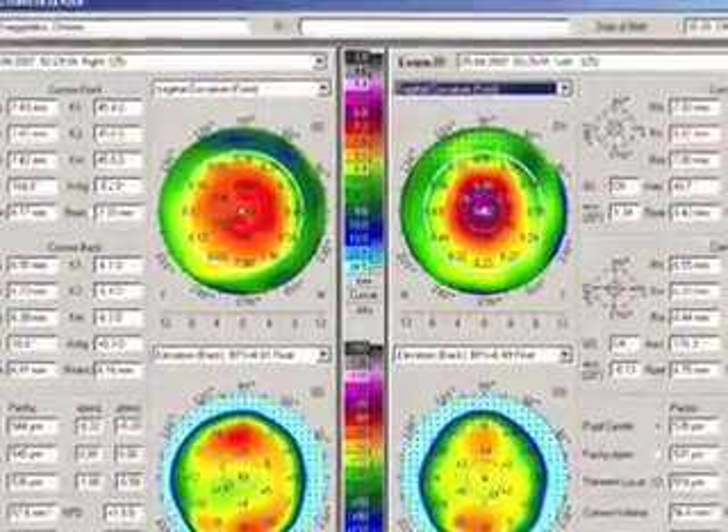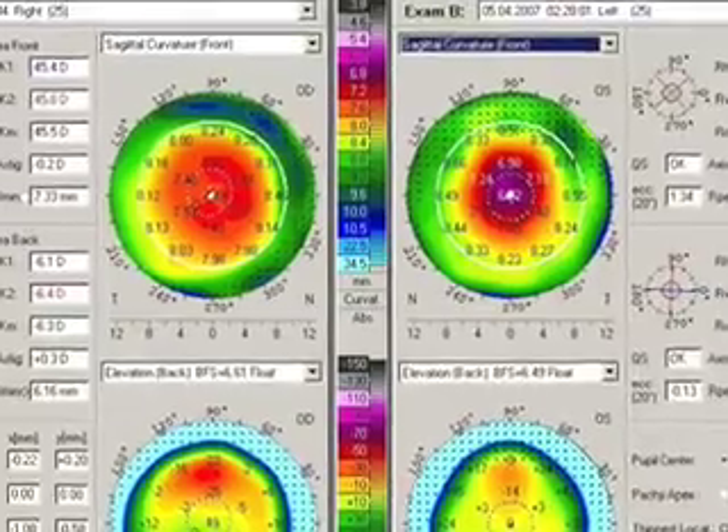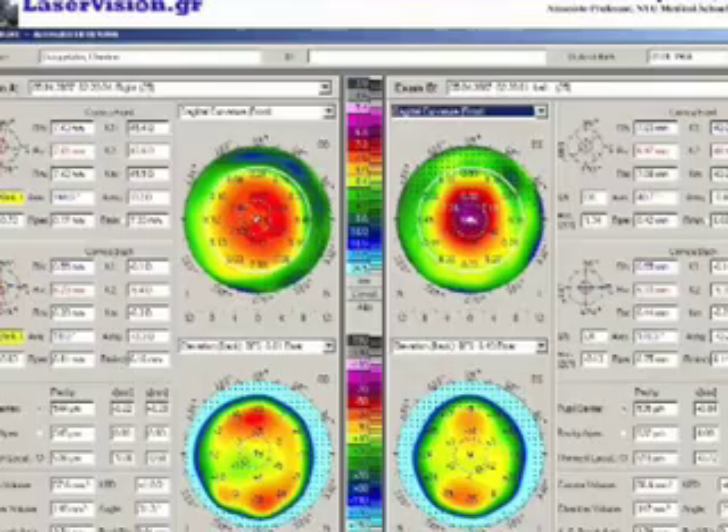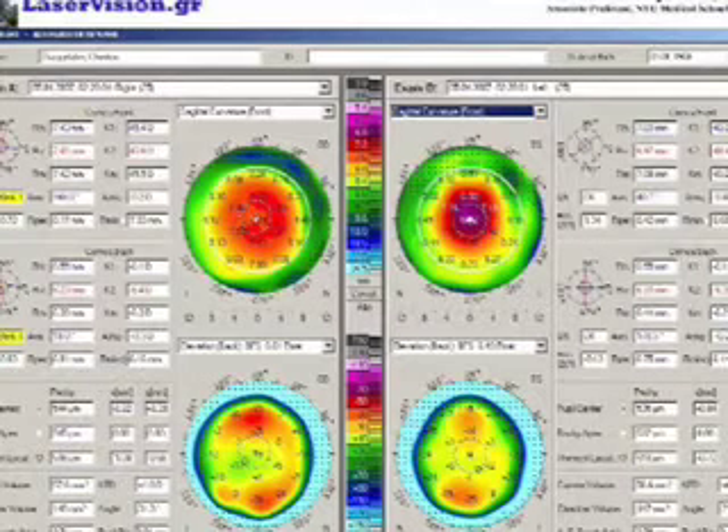Here on our left side is the right eye, and you can see that the ablation is slightly de-centered nasally and appears to be much larger than the ablation we're seeing on the right, which is the Pentacam of the left eye that received the standard treatment. Thank you very much for watching.